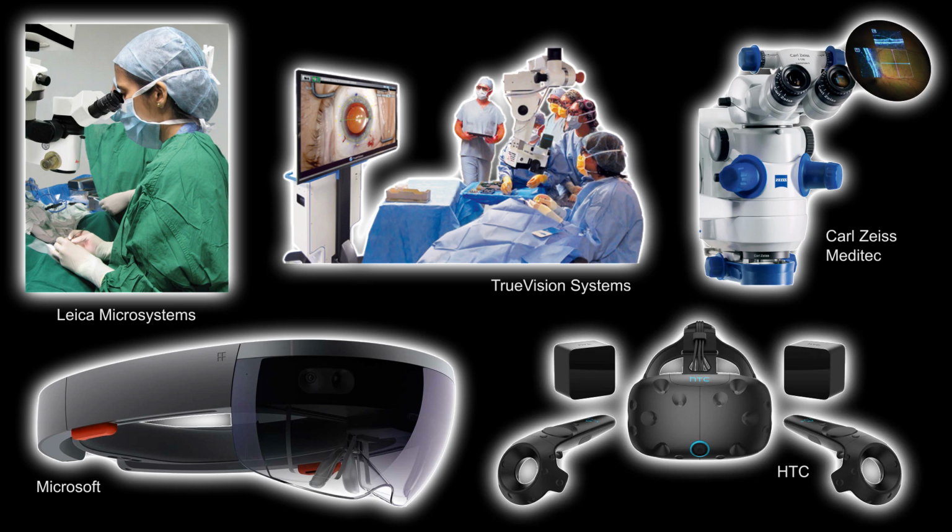This brings us to virtual reality displays, where not only is the wearer's field of view unlimited, but the display device is in complete control of their visual inputs. VR consequently offers unparalleled display opportunities, but this comes at a cost. The control software must meet aggressive rendering requirements to avoid causing motion sickness. Frequently, this means rendering at up to 90 frames per second for each eye.